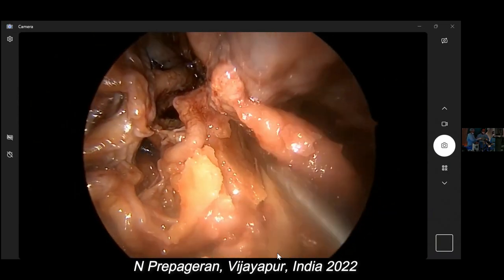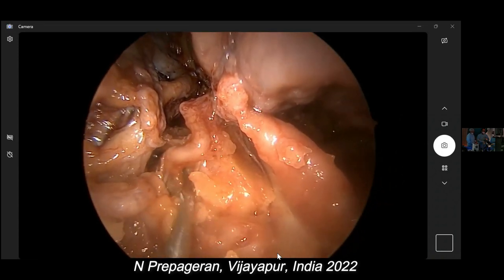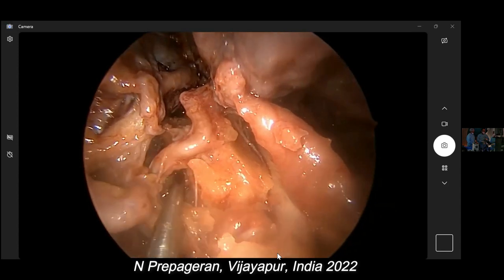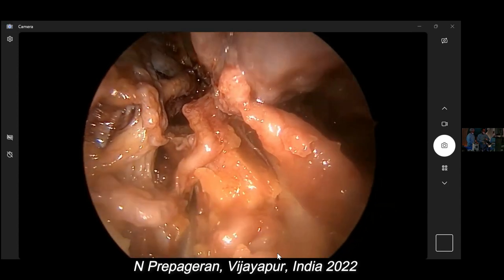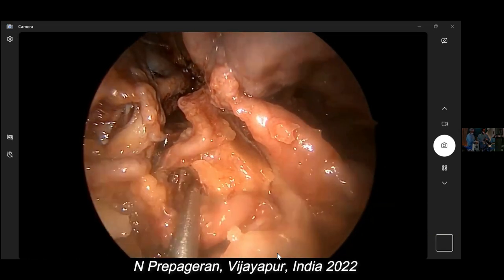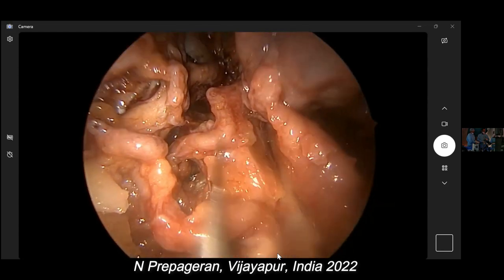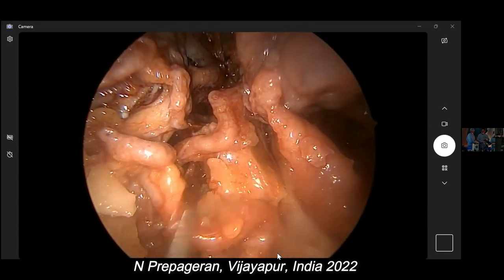Okay. Got it? Sir, till how long do you drill out that wedge in angiofibroma? There. So if you want a better view, let me see. I go in front here, maybe it's easier for you to appreciate. Okay, this is better. Medial pterygoid. Lateral pterygoid. This is the pterygoid wedge.